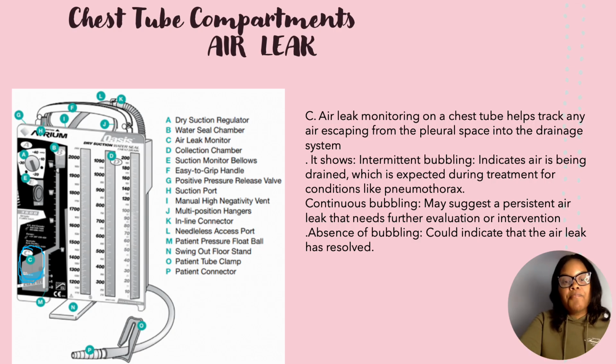And we want to look at our air leak monitor because it will actually tell us how big of an air leak we have. So if you see absence of bubbling, then that is good. That could indicate that the air leak has been resolved.